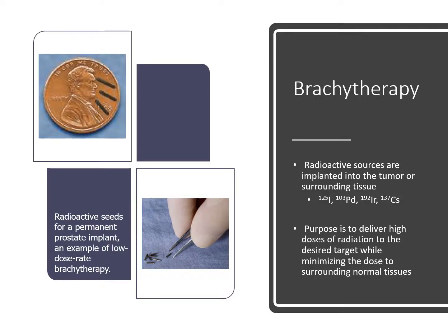Okay, so the third type of radiation therapy is brachytherapy. In this picture, you can see small seeds. I don't know what to compare them with, but these small seeds are like pencil leads, like the lead of a pencil, that is inserted into the tumor.